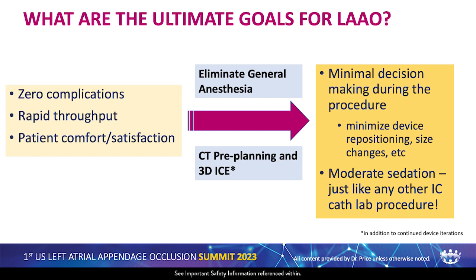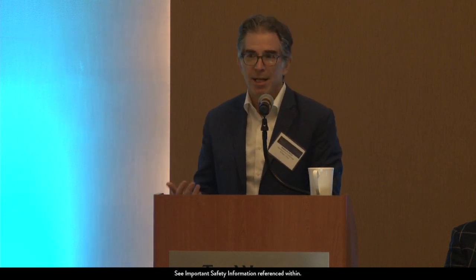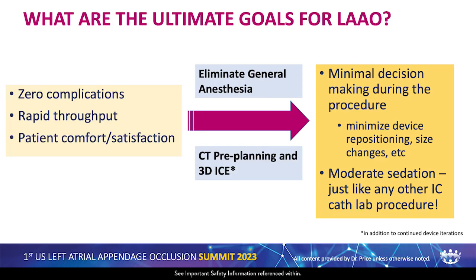Just for me, like any other interventional cardiology procedure, I know you're in the EP lab, you're more used to using an anesthesiologist, but if you can knock out 8 cases in a day, or 10 cases in a day in 2 rooms versus 3 or 4 in 1 room, that's going to be really helping your cath labs. And I think the future for that is eliminating general anesthesia and definitely using CT pre-planning and 3D ICE.